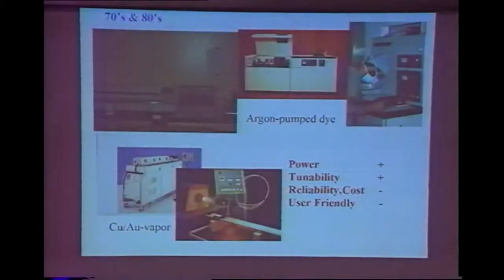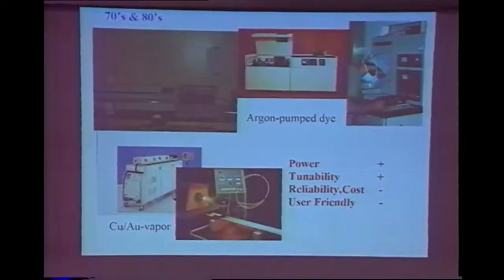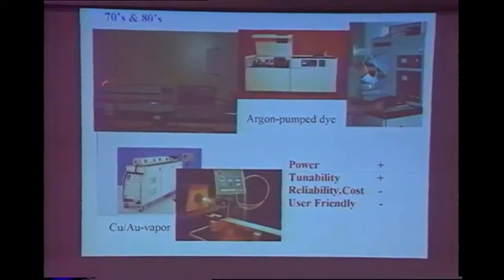If you look at the history of the development of light sources for PDT, this is the 70s and 80s. So I showed you this yesterday, this slide from Roswell Park of a scientific argon pump dye laser in an operating theater.